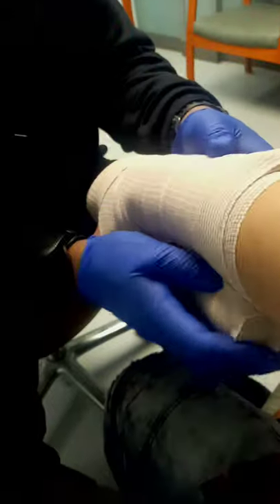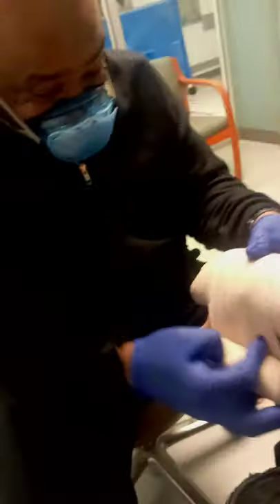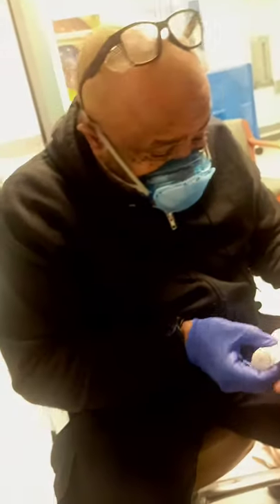I'm going to take another wrap so that it doesn't irritate. While you have this on, this isn't going to irritate your arm and make it feel itchy. I feel a sensation with pressure right there, which is a good thing — you want to feel sensations. The last thing you want to feel is nothing, because if you feel nothing, you're not getting blood flow.